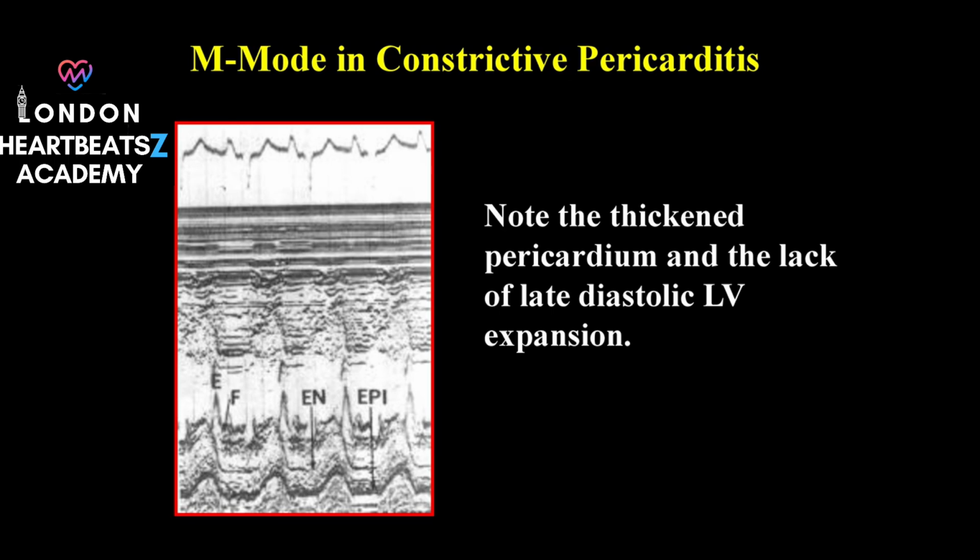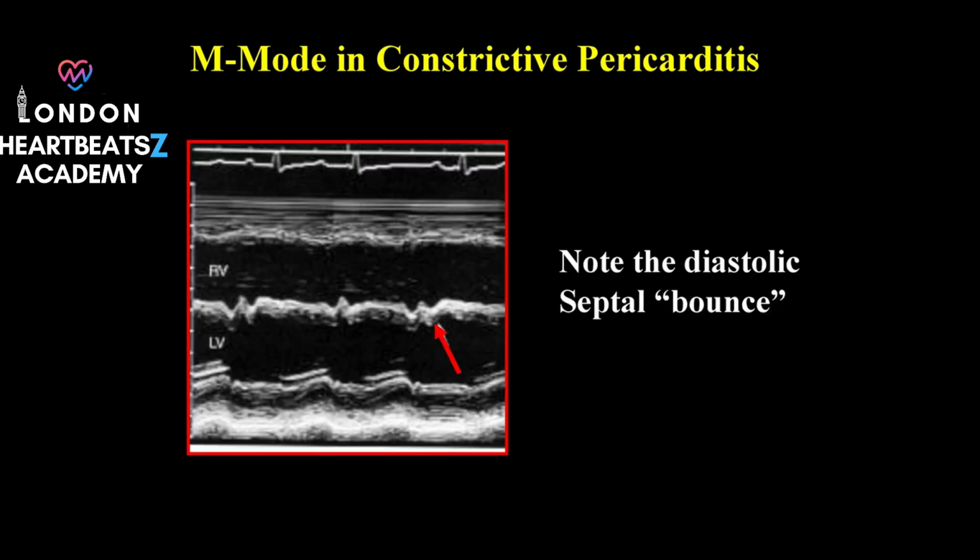So it's like adding real-time traffic information to a roadmap of the heart. What kind of things can you see with color M-mode that you can't see with regular M-mode? With color M-mode, we can see the precise timing of valve movements, the speed and direction of blood flow through the valves, and even identify any areas of turbulence or backflow. It's incredibly helpful in assessing valve function and understanding how blood is actually moving through the heart.